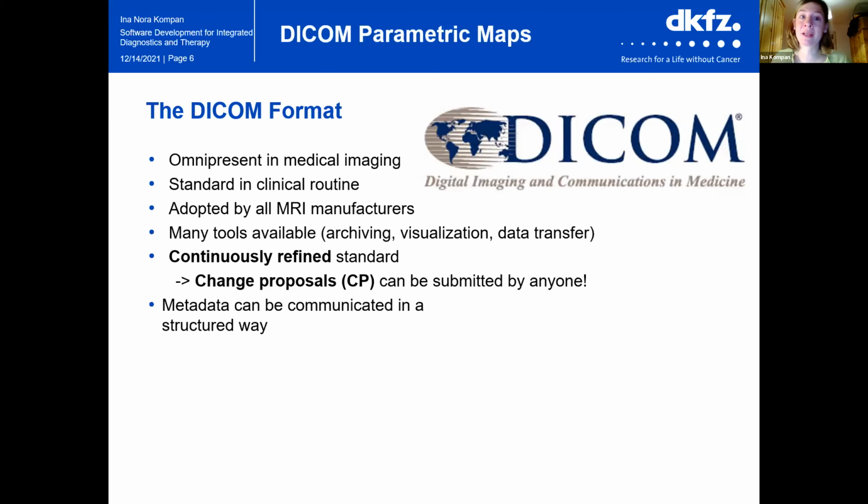First, I'd like to give you a quick introduction to the DICOM format itself. So the DICOM format is basically omnipresent in medical imaging. It is the standard in clinical routine, and it's been adopted by all MRI manufacturers. And also there are many tools available for archiving, visualization, and data transfer.